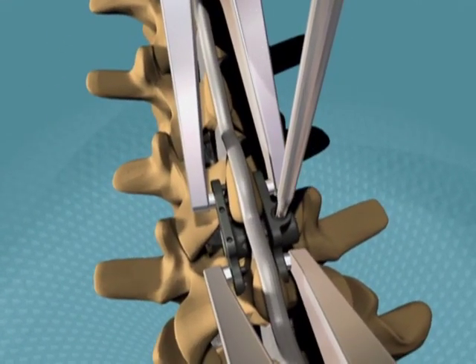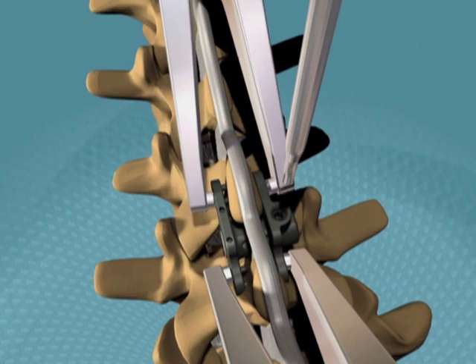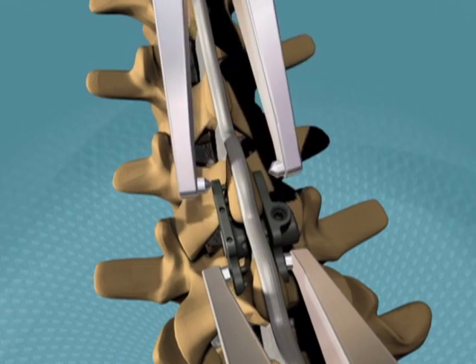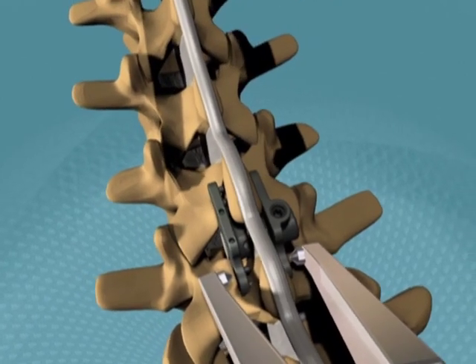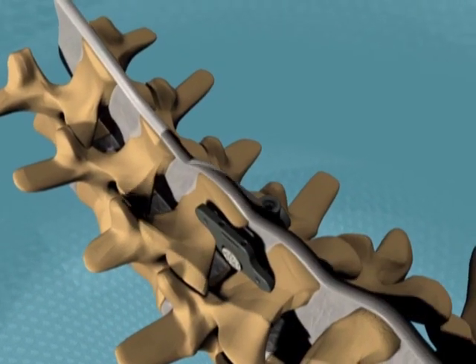While maintaining compression on the plates, tighten the locking set screw until the torque handle clicks twice. Remove the compressors. Visually and manually inspect the plate to confirm secure fixation. Check placement of the device using X-ray or guidance equipment as needed.